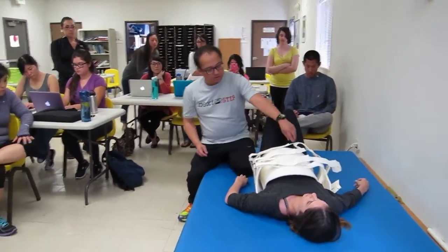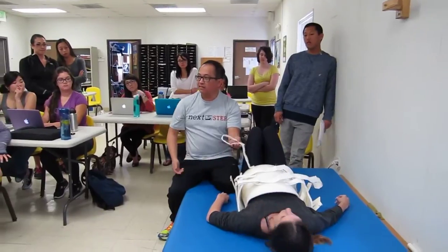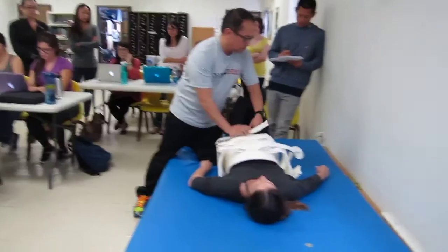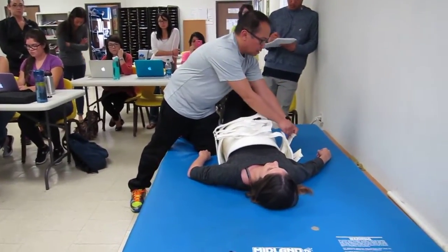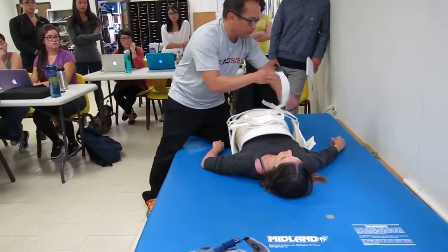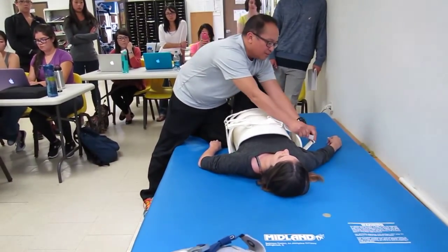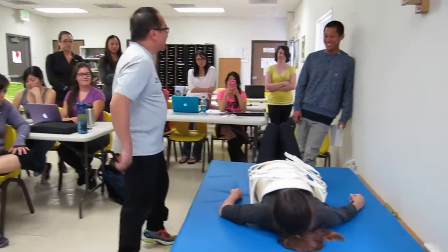One of the things too, when you are removing this, make sure that you stick it back together like that, because otherwise it gets all screwed up and flopping around. Obviously, this was made for a person that was maybe 5 times Megan's size.